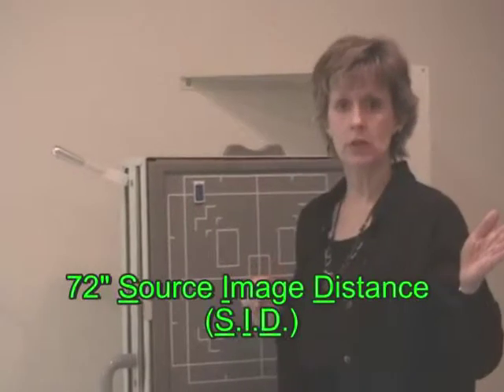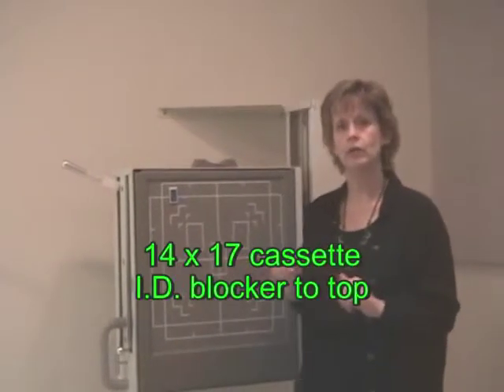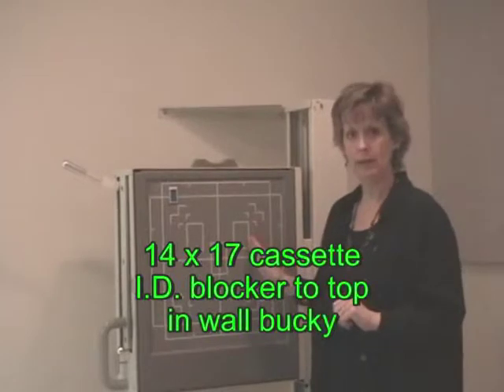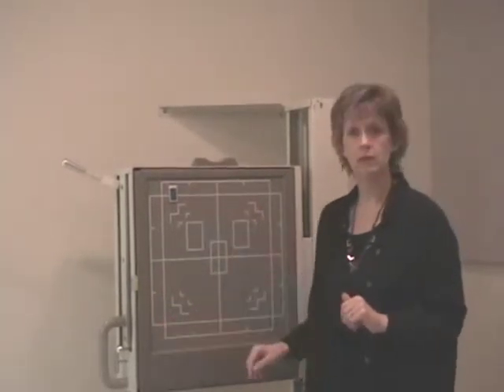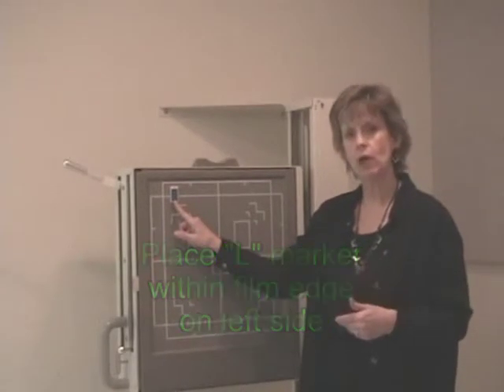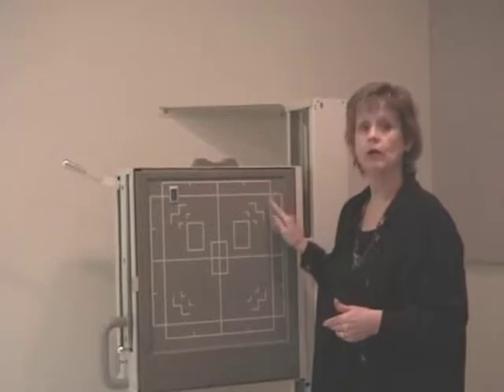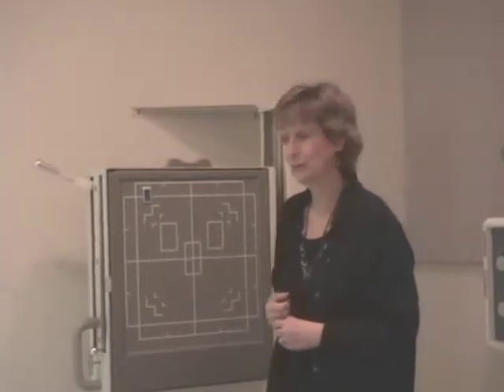Again, 72 inches SID, 14 by 17 cassette, ID blocker to the top, in the wall bucky, collimate to the 14 by 17 field, and put an L or an R marker on there. If you were choosing an R marker, you'd put the R marker on this side. Okay? We're now ready to go get our patient, assuming that they're dressed.